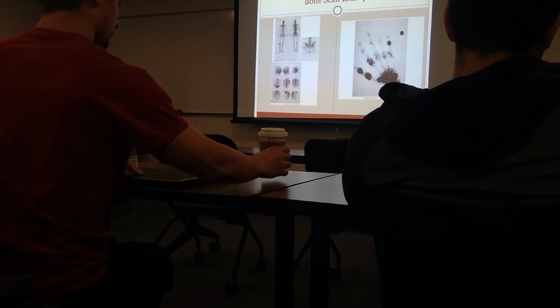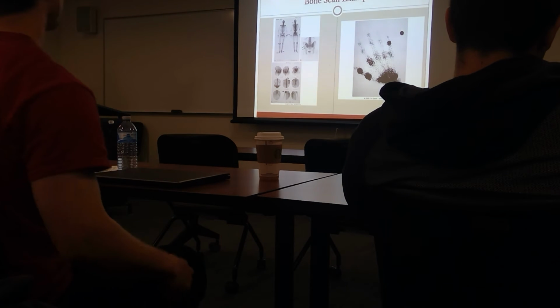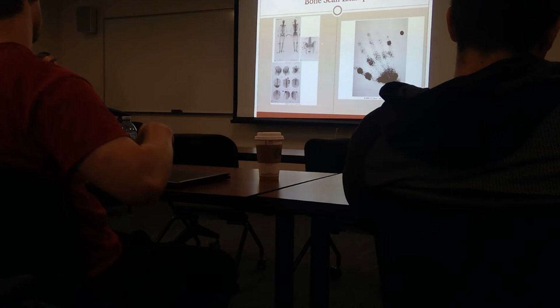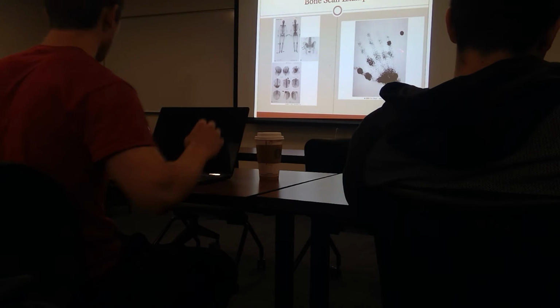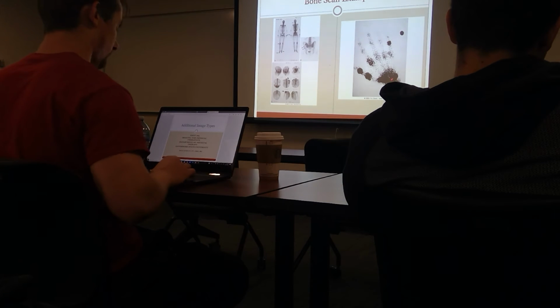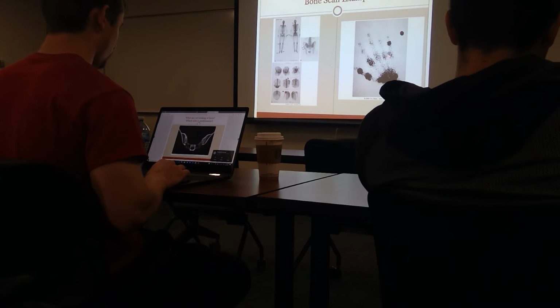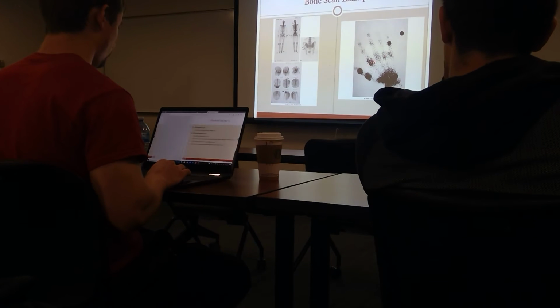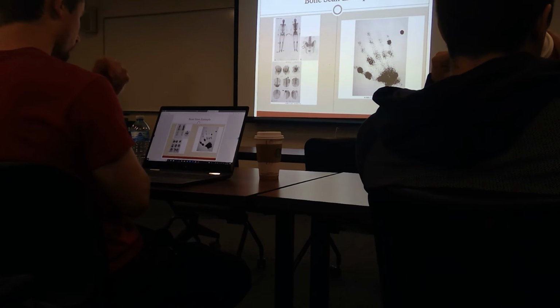Okay, we got a couple of different things here. So if we look at this, and we go through our bone scan example, looking at this one, what do we think this might show? Obviously it's of the hand, but if we look at the wrist and the MP and the IP joints all the way across, think back to Dr. Deers' and my lecture on the ortho hand. What condition does that really highlight? RA. Right. Yeah.